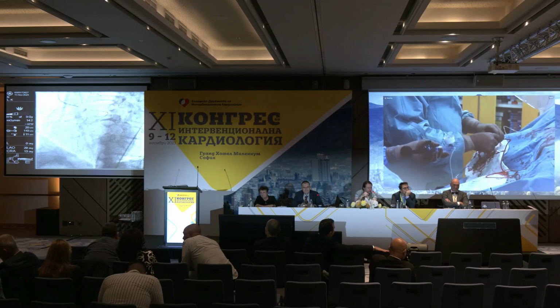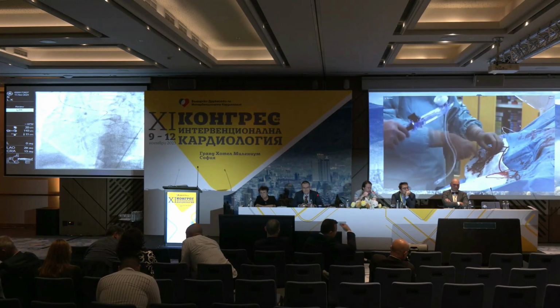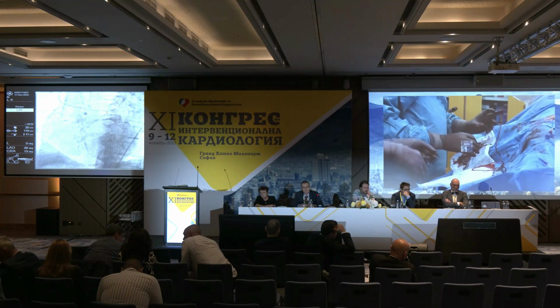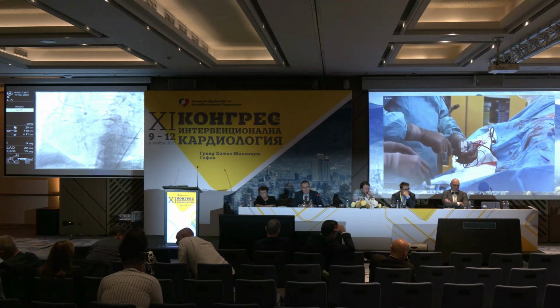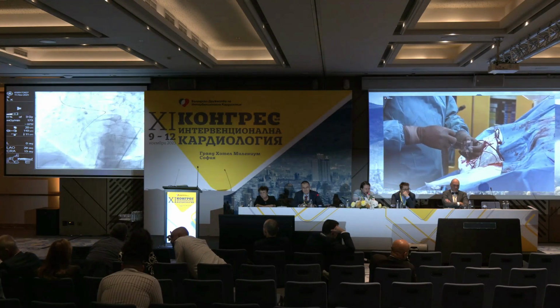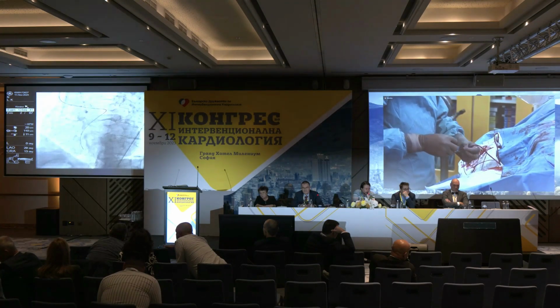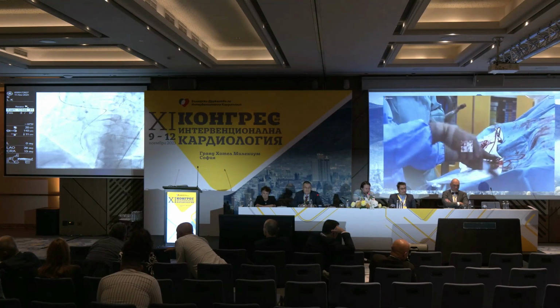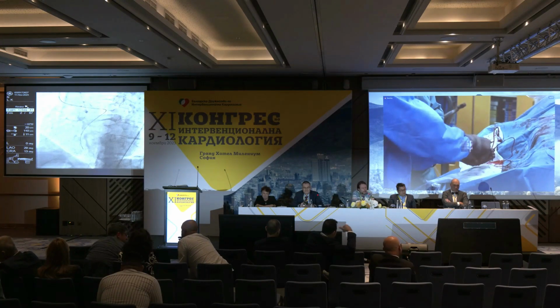I am confident to give some contrast antegrade, just for us to orientate, because we started late. Let me clear just a little bit of this. There is a small piece of air here. That's good. I will give a small puff there just to see if we can orientate ourselves in the direction of the vessel. That's what you see. It's true-to-true crossing, no doubt about that. That's why we give contrast. If you don't achieve that, then you don't.